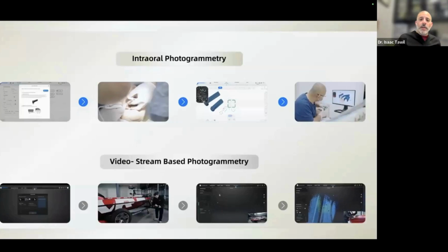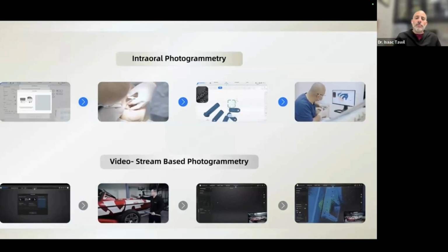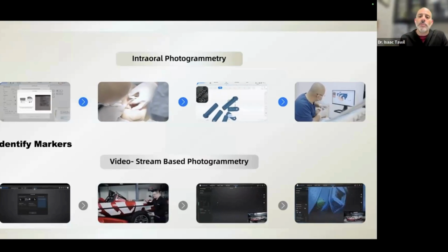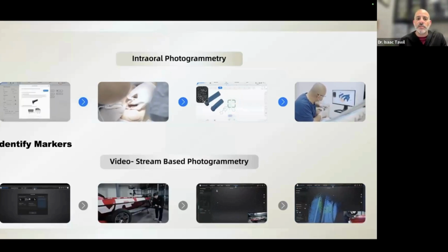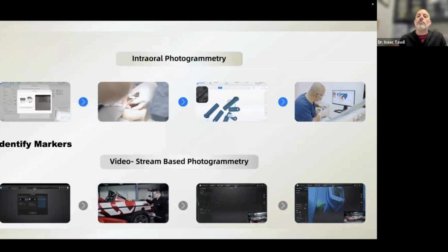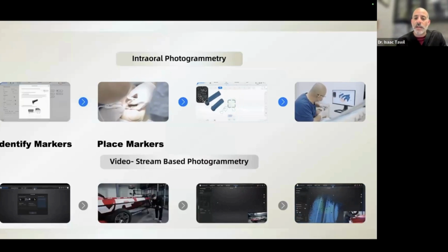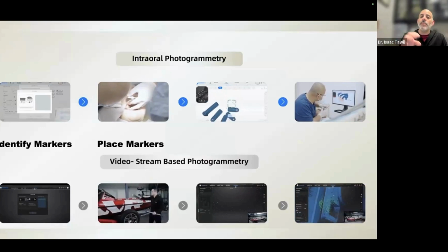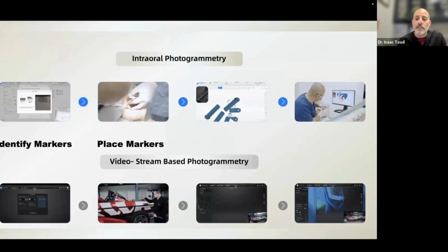So that's the basic idea behind it. And what we can do now when we have these cameras, so it is true photogrammetry, we can identify the markers. We can say, hey, I only want you to scan these markers when I'm using the photogrammetry portion of this software. I want you now to place those markers, and whether it's in the industrial sector, as you see down at the bottom, or in dentistry, where we're installing them in the mouth on top, we can capture boats, planes, objects. It makes no difference. It's the same ideology and same technology.